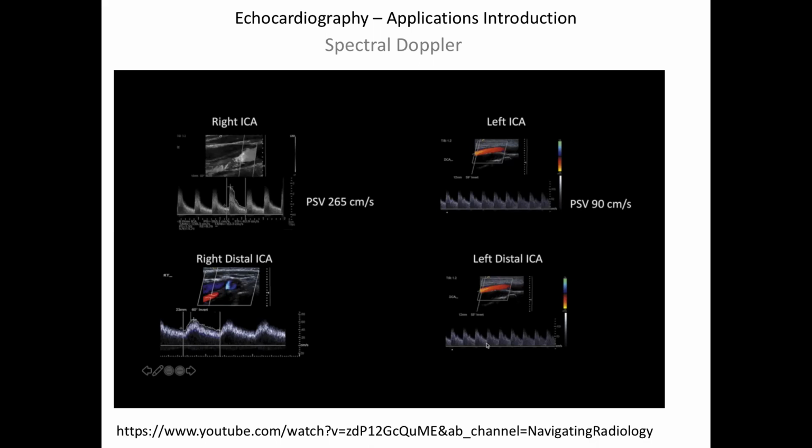So if you're gonna do some kind of Windkessel model of where blood flow is going, et cetera, the time constant for this decay has changed. And you can look at it obviously in this proximal view, and then you look distal farther down the vessel to see what it looks like, and then compare those two.